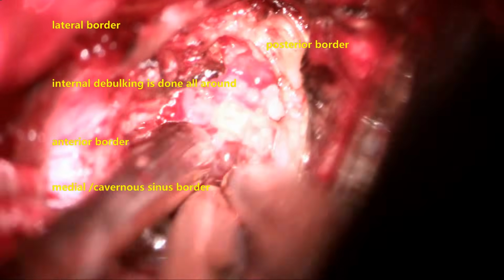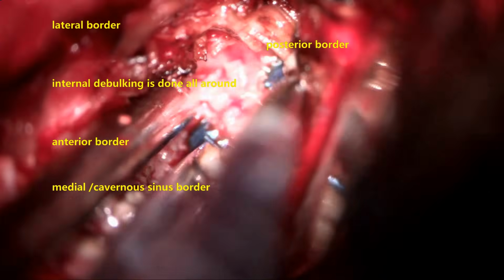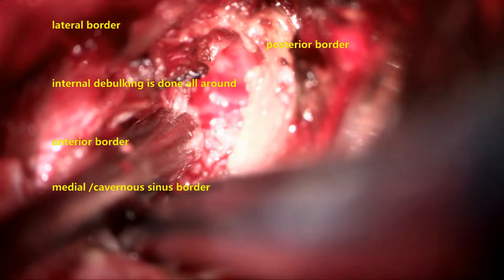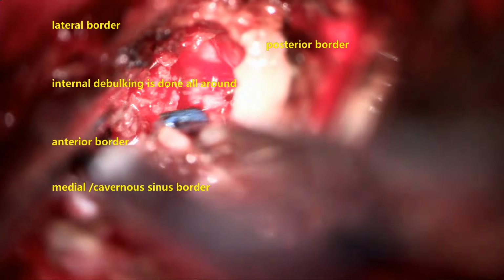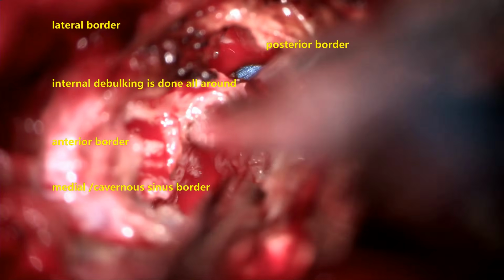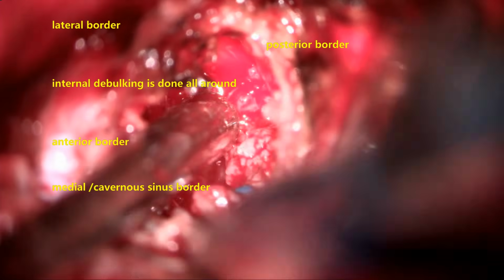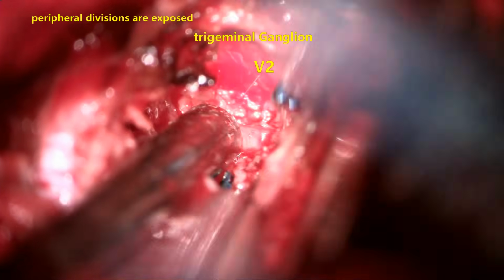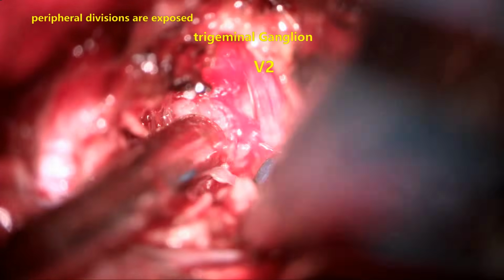Now we are going posteriorly. Always keep looking for the branches. Now you can see we have reached the trigeminal ganglion posteriorly, and you can see the nerve root there. Probably that is a maxillary division, and the tumor is being separated from the maxillary division, that is V2.